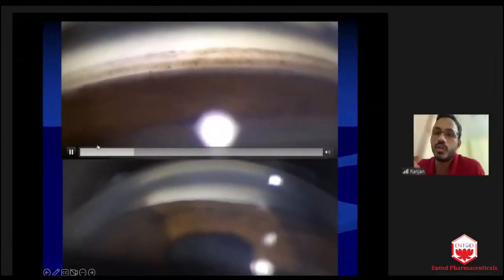In the upper one, we can see the trabecular meshwork. In the lower one, that structure is not visible. Very good. All of you should concentrate on these two videos. If you learn these two videos, then you have learned gonioscopy.